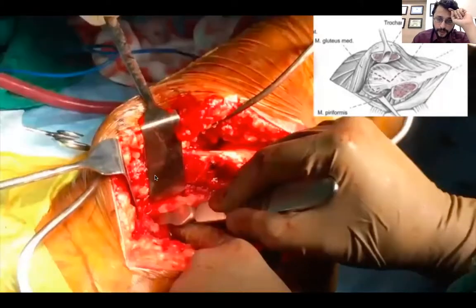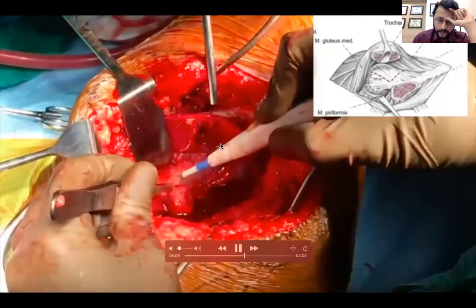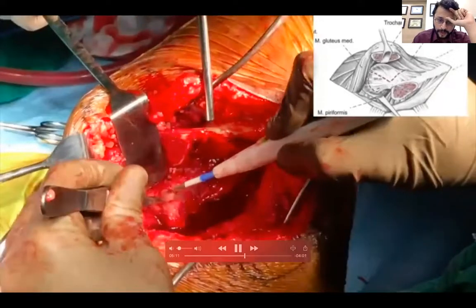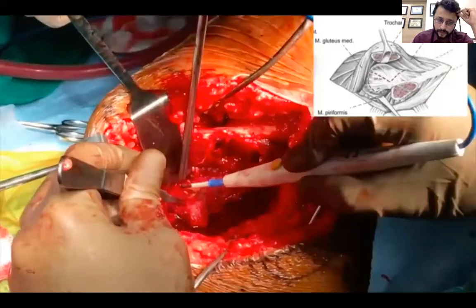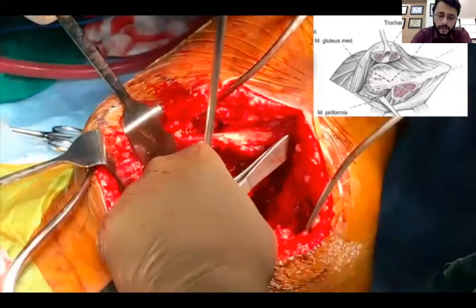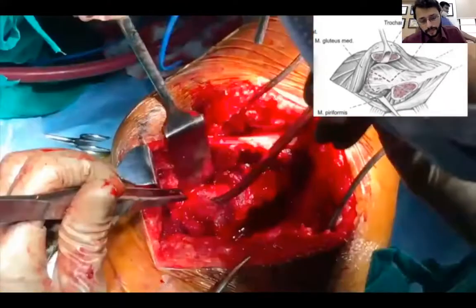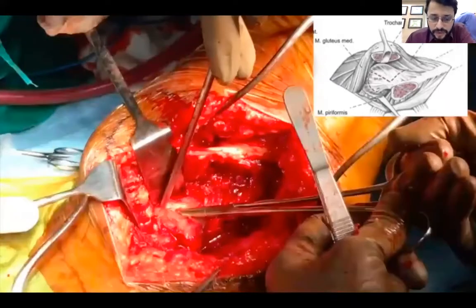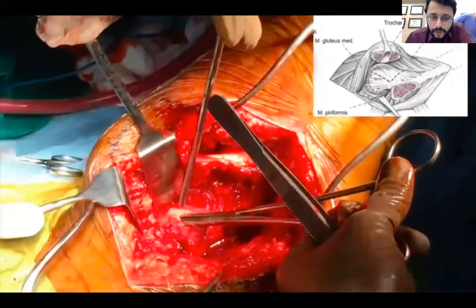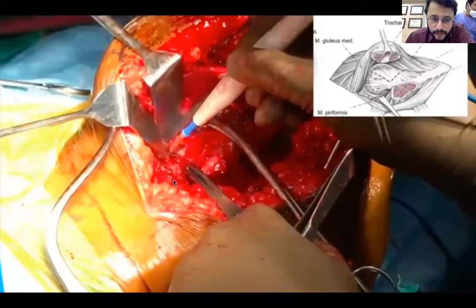All right. Then I'm going to do a capsulotomy. Now this capsulotomy is a Z-shaped capsulotomy. Anterior aspect of the femoral neck. And as you can see, there's this hemarthrosis which is drained, which shows that it is an acute unstable slip. You can see that blood oozing out. And then you take this cut right till the level of the acetabular labrum.